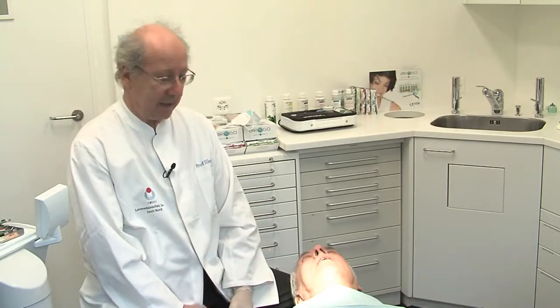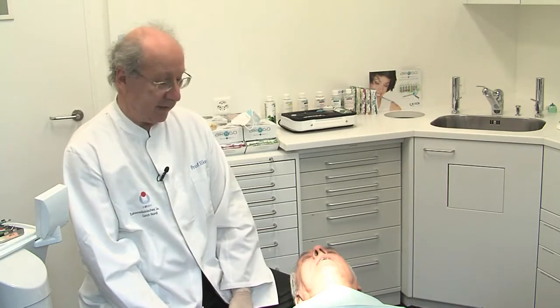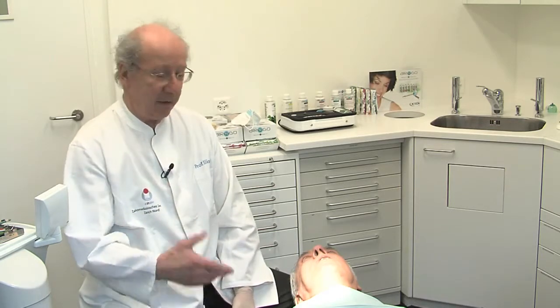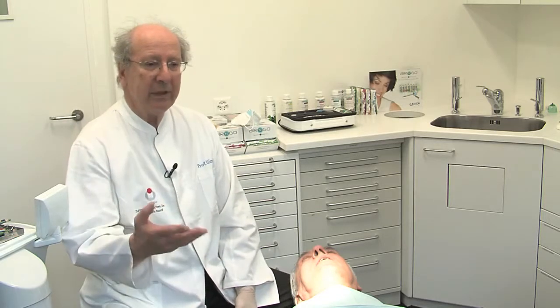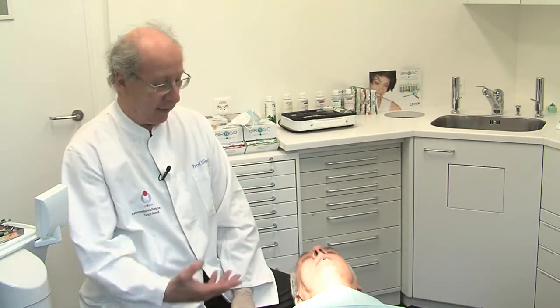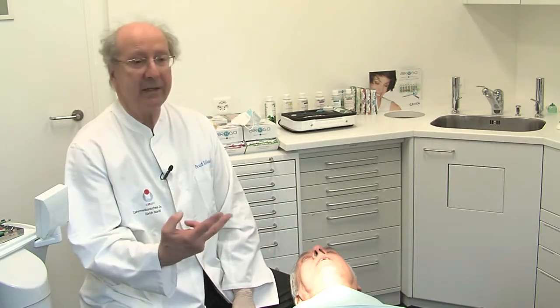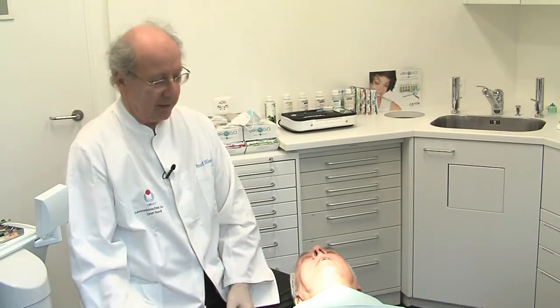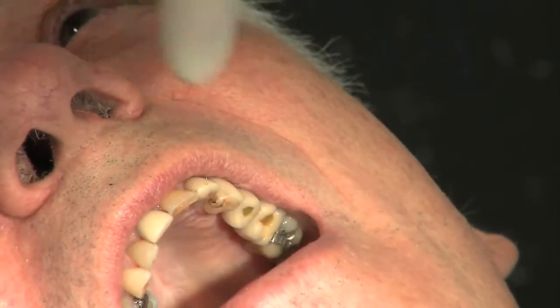This is our patient who had a history with periodontal disease during the last year. He also lost some teeth. Two to three years ago we treated the periodontal disease, and now one and a half years ago he got two teeth replaced by implants. He has the implants here on the left side in the upper jaw.